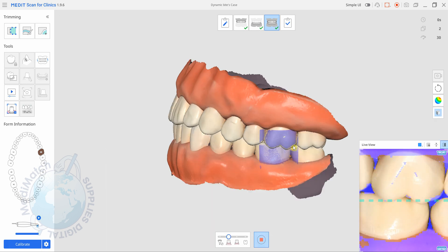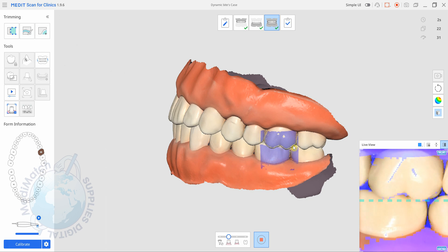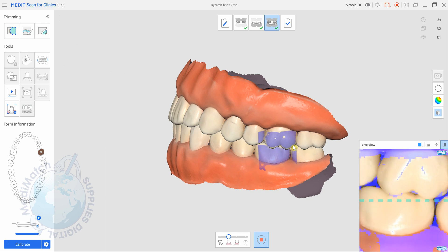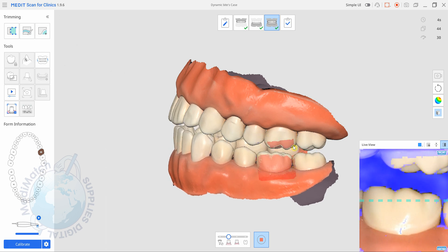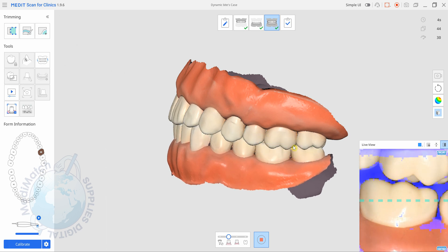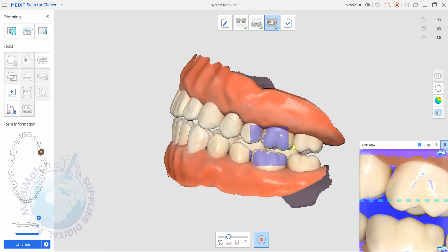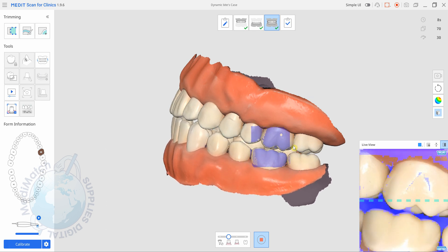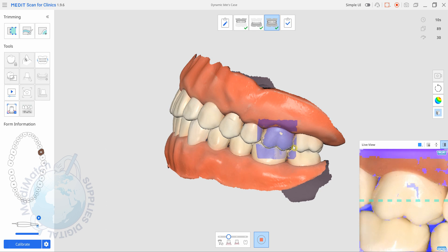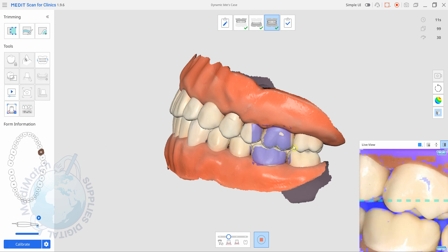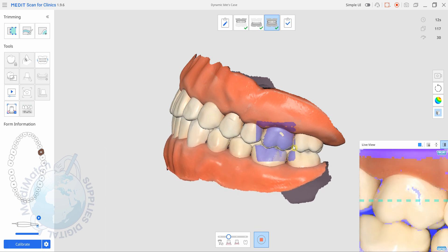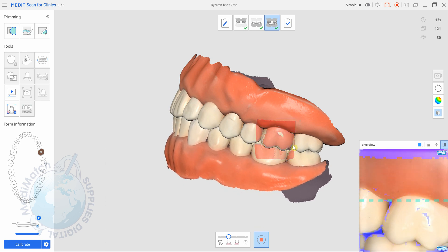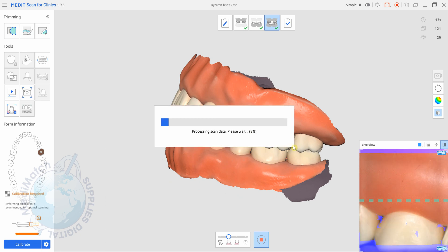So tap the scan button, let it find its position and then we can ask the patient to move to the left, tap the stop button and it'll process that one.